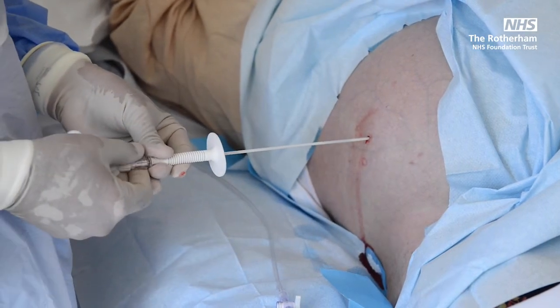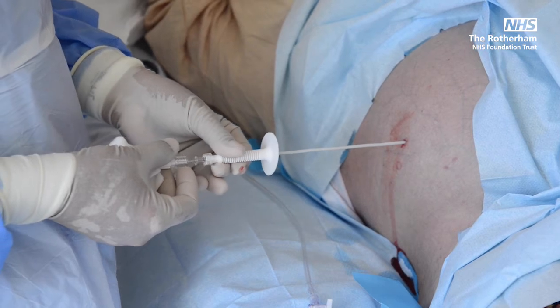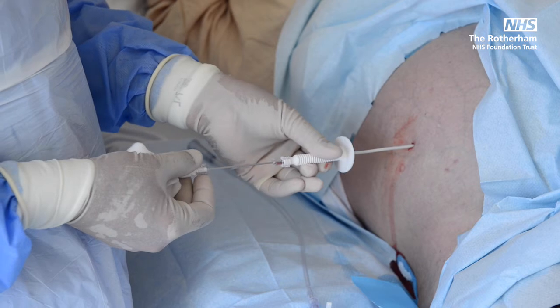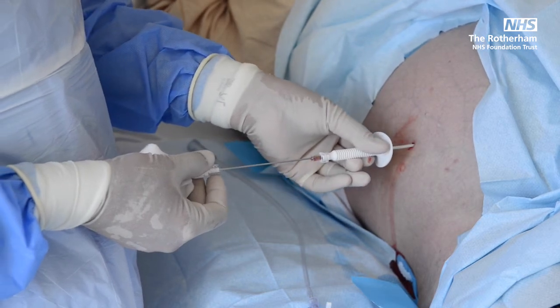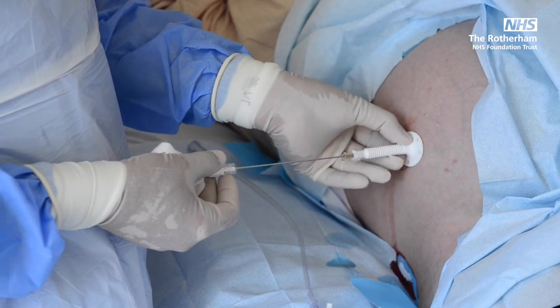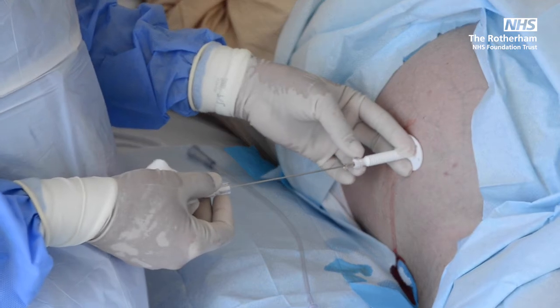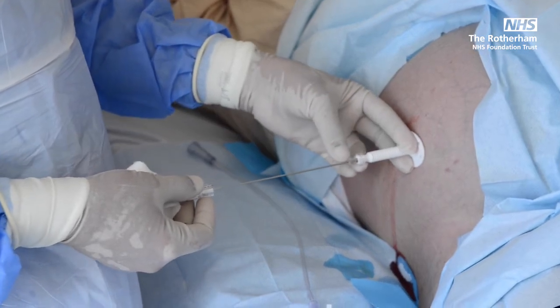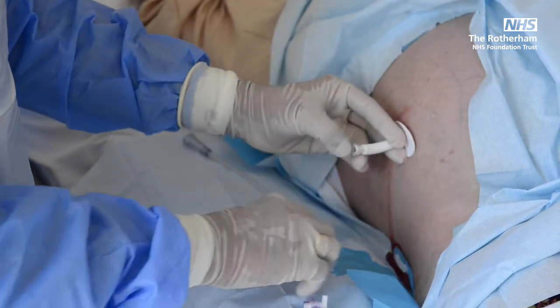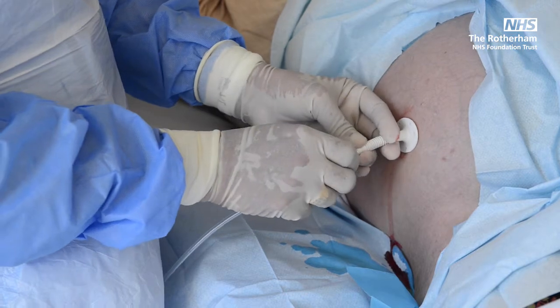Undo the screw at the bottom and keep the needle there, and slowly introduce this catheter into the peritoneal cavity. Make sure that you don't take the needle out at all, otherwise it will kink. So I've introduced it completely. I can see the ascitic fluid coming out already. I'll take the needle out now and close that end and put this catheter onto there.